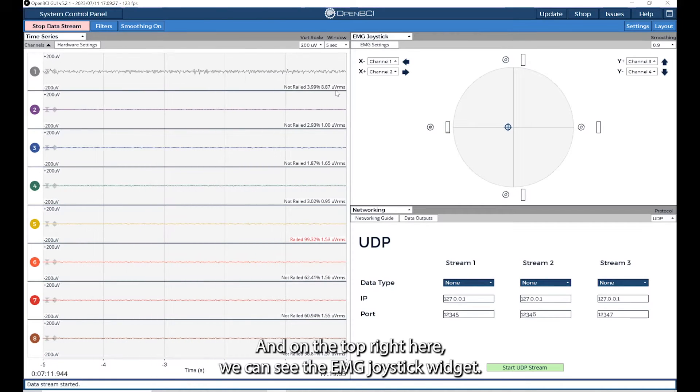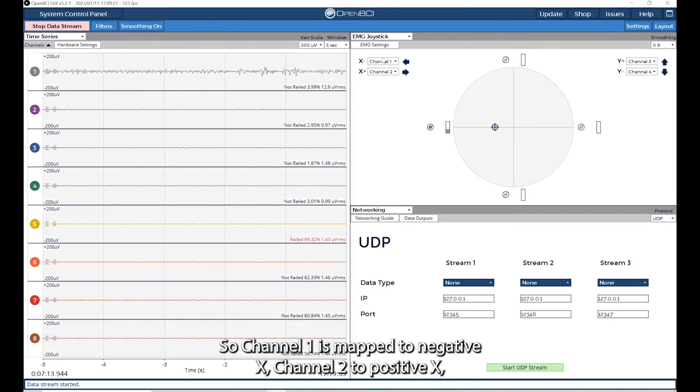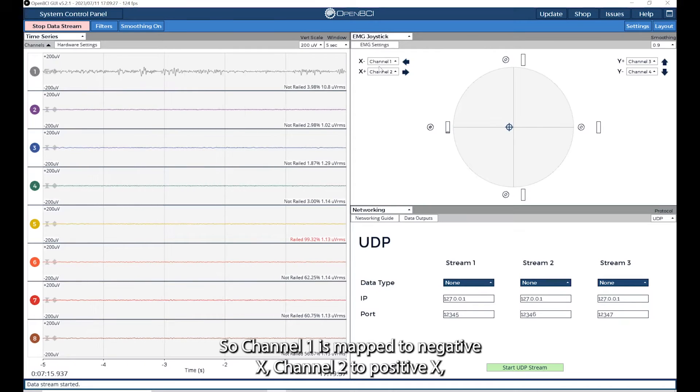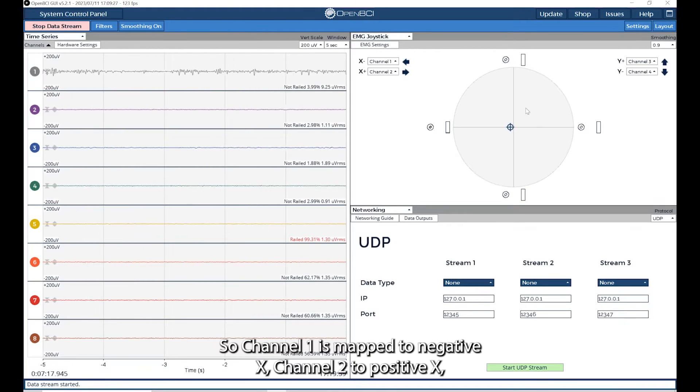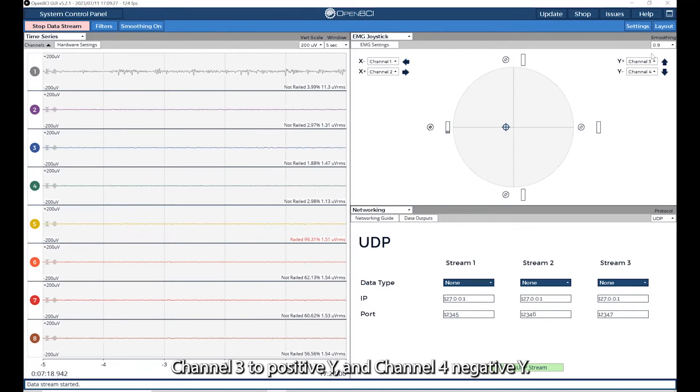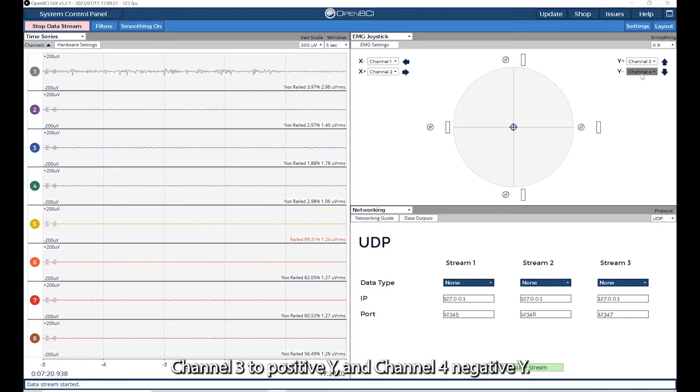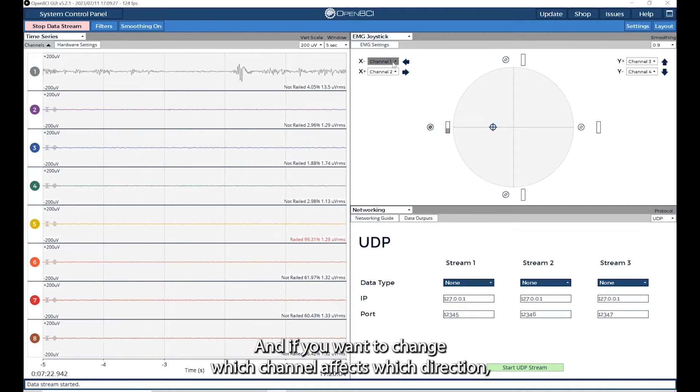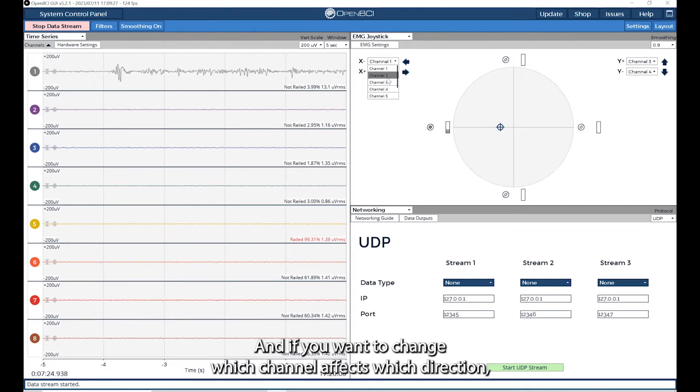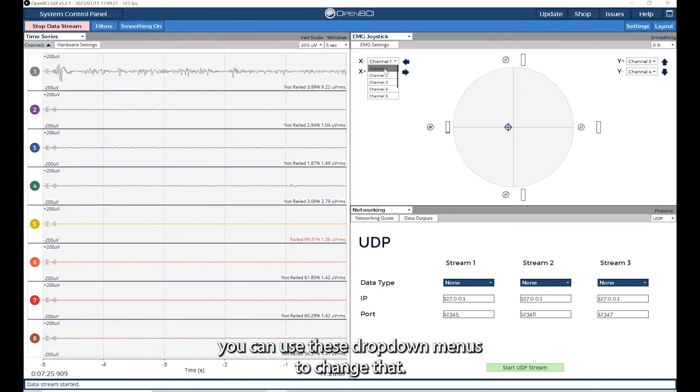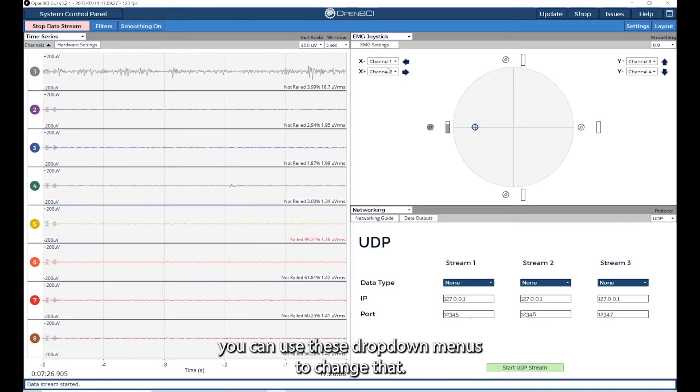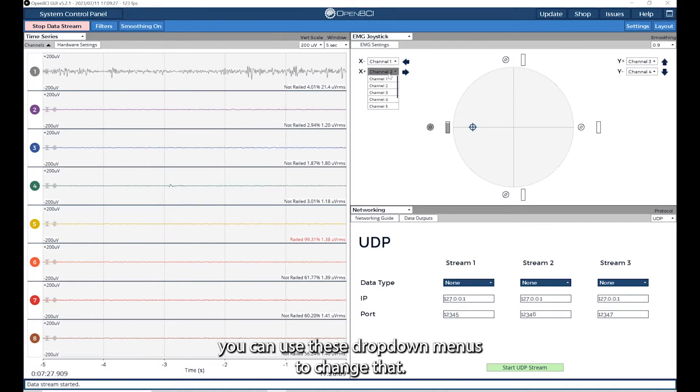On the top right here, we can see the EMG joystick widget. Channel one is mapped to negative x, channel two to positive x, channel three to positive y, and channel four to negative y. If you want to change which channel affects which direction, you can use these drop down menus to change that.